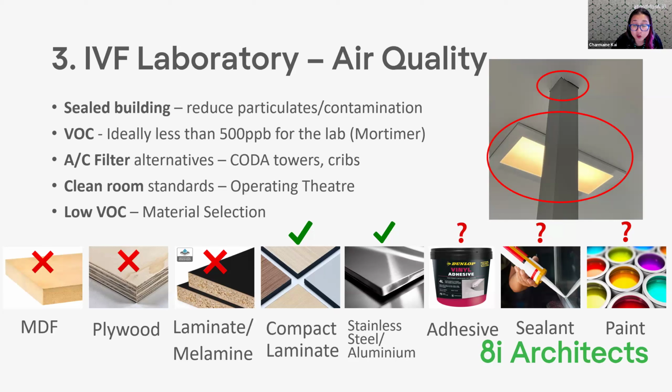And a lot of times, even though a lot of products say they're low VOC, particularly paint, they're all heading towards low VOC now, but not all low VOC paints are still suitable for a lab. When products say they're low VOC, that's low VOC for humans, so fully grown humans. It's not suitable for an embryo or gametes. The threshold for low VOC well exceeds what we would find acceptable in an IVF lab.